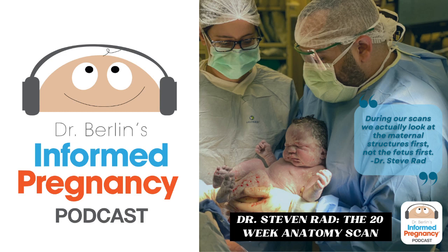The cord. Oh, okay. The cord. And the umbilical cord, and then next we look at the next maternal structures. We look at the ovaries or adnexa on the sides to see if there are any cysts in the ovaries or any uterine fibroids that we need to monitor during the pregnancy. So those are the basic maternal structures that are looked at.